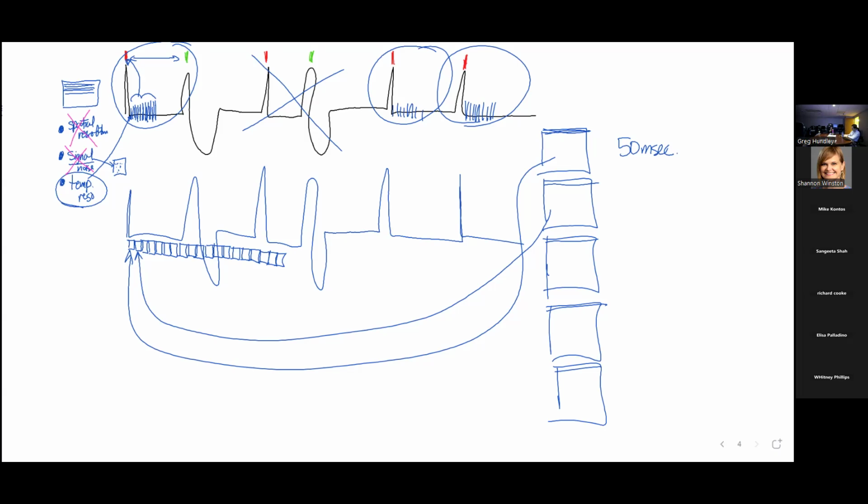And that's called real-time imaging, and guess what? You don't need to hold your breath. So when you get in a jam, you've got an uncooperative patient, they're very ill, their heart is very sick, there are tons of ventricular ectopy, we switch over to real-time images.